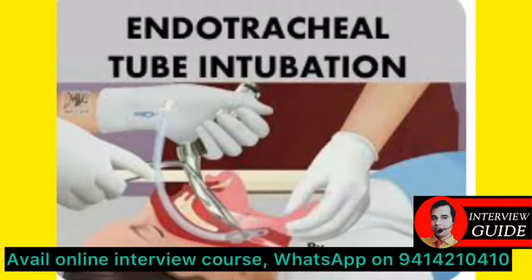We also require a 10 ml syringe to inflate the cuff of the endotracheal tube, and a self-inflating manual resuscitation bag valve mask device. A suction catheter is also required, and a stethoscope and monitor should be placed near the patient and attached before the procedure. A disposable end-tidal CO2 detector is also required. These are the equipment required for endotracheal intubation.